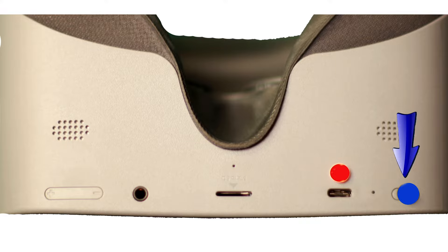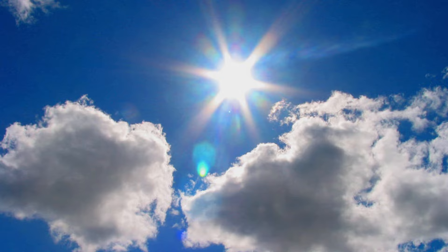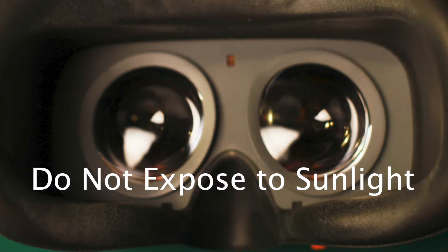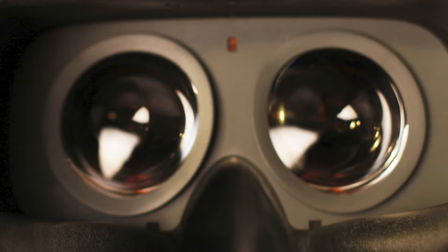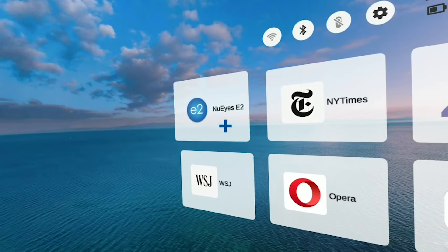Hold or press the on button. You'll see a NewEyes logo and then you'll hear a little jingle. A disclaimer will pop up telling you not to wear the glasses while driving or walking. You'll also see a warning not to let direct sunlight hit the lenses inside of the E2, as this could cause permanent damage to the glasses. Acknowledge the warning screen in the viewer and proceed with setup.